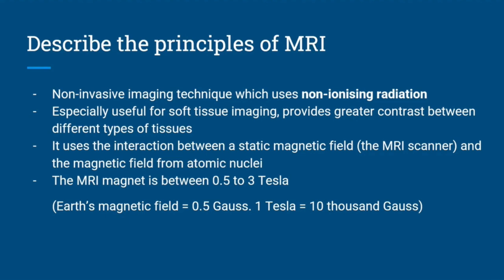You effectively need to align the spins of the protons, and then you make them all flip by shooting a radio wave at them, and then when they flip back to their ground state, they release energy, and then that wave of energy is collected or measured, and that gives you an image, something along those lines. Yeah, that's a pretty good summary of it.